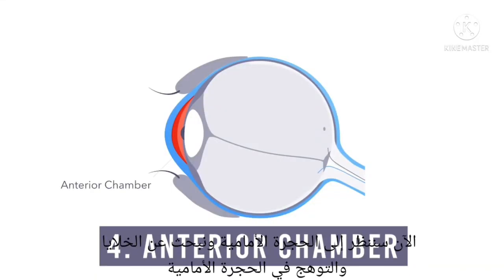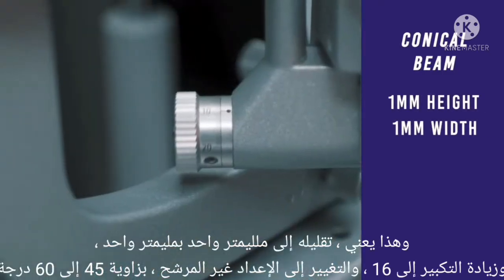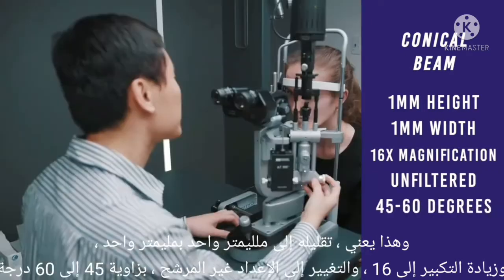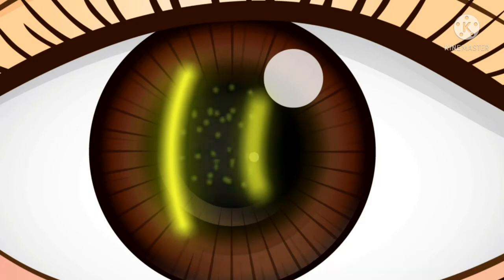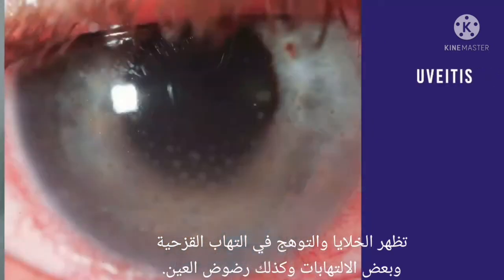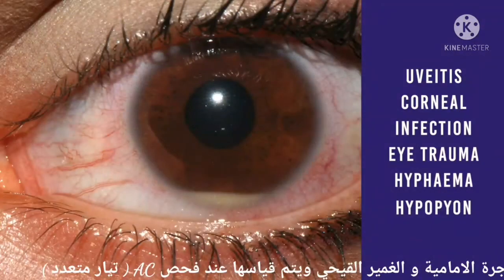Now we'll look at the anterior chamber. And we're looking for cells and flare in the anterior chamber. So you want what's called a conical beam, and this means reducing it to 1 millimeter by 1 millimeter, up the magnification to 16, change to the unfiltered setting and angle at 45 to 60 degrees with a pupil as a black background. Cells in the anterior chamber look like the particles of dust in a projector beam that you see in the movies. Flare in the anterior chamber looks milky or whitish grey. Cells and flare are seen in uveitis and some infections as well as eye trauma. Hyphemas and hypopyons can also be seen and measured when you examine the AC.